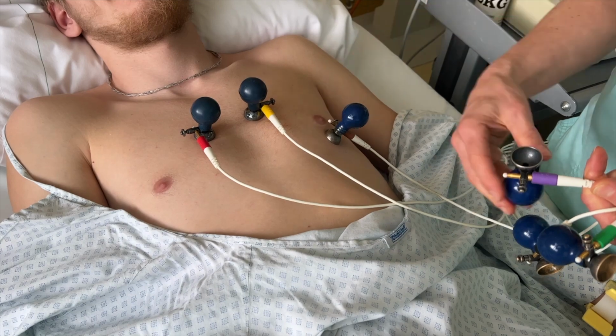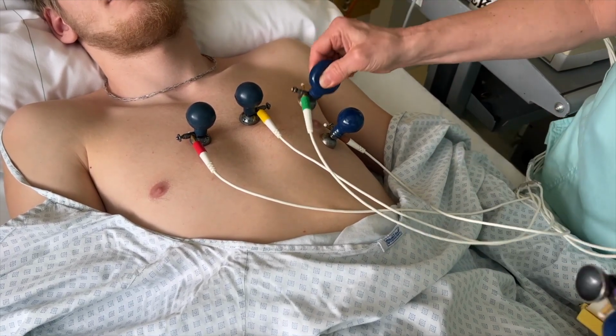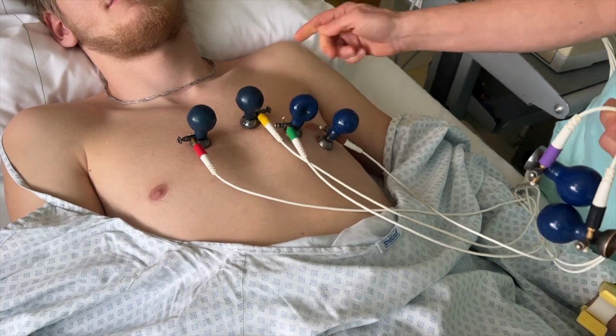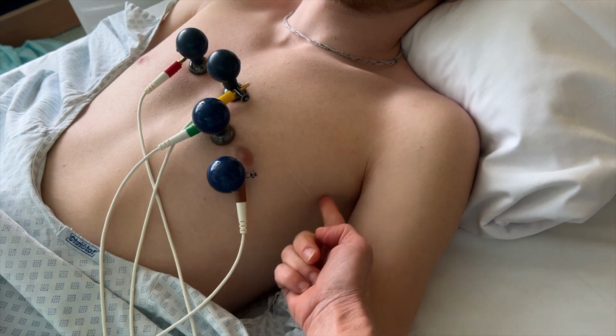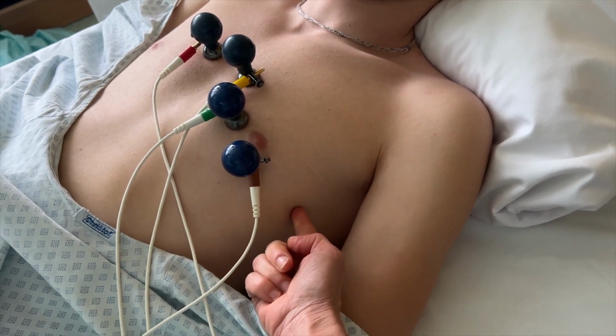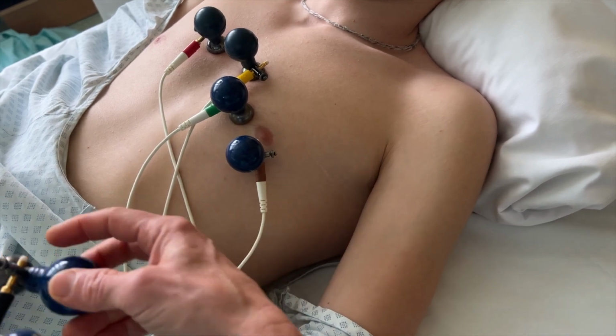The third lead is placed on the line connecting the second and fourth leads. The fifth lead goes in the anterior axillary line at the fifth intercostal space. The sixth lead goes in the mid-axillary line at the fifth intercostal space.